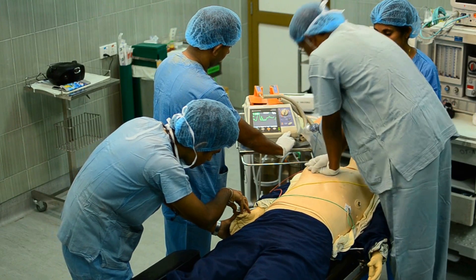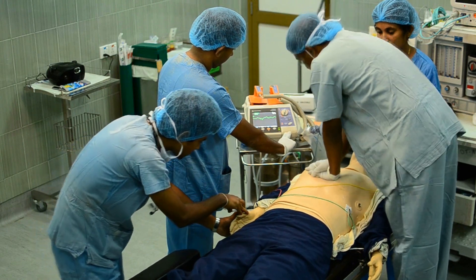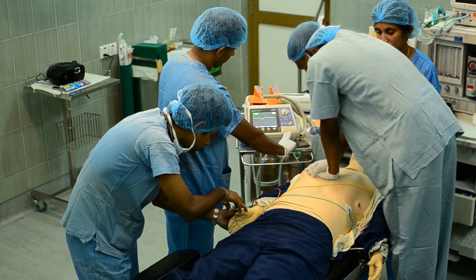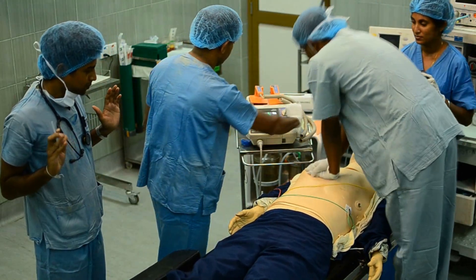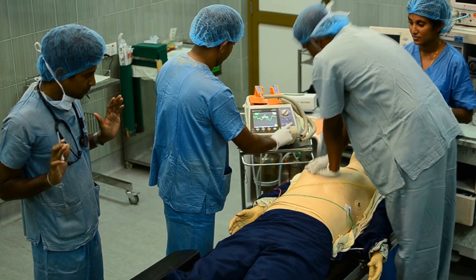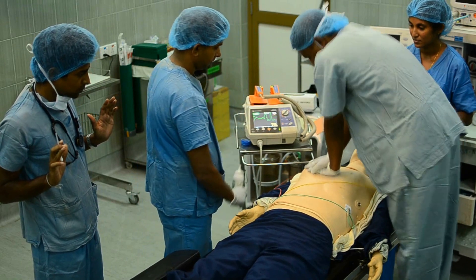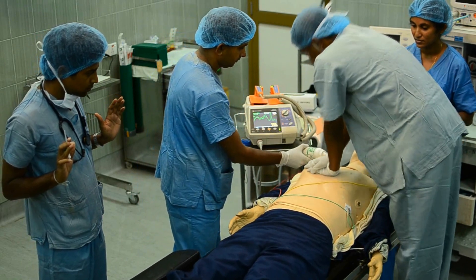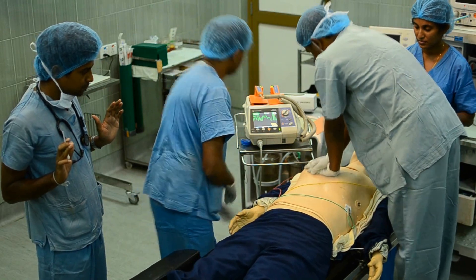Prepare for shocking. If the rhythm is shockable, you have to prepare both the defibrillator and the patient for shocking. Make others and oxygen away. Select the energy by turning the dial to the required energy level — that is, 150 joules at the first attempt. Press the charge button to charge it. Apply electro-conductive jelly over the apex and right clavicle.